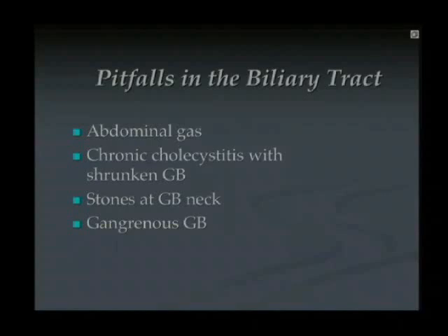Now, obviously, that patient is going to be toxic. You're going to have a clinical awareness that something's wrong. You're going to get a CT, etc.